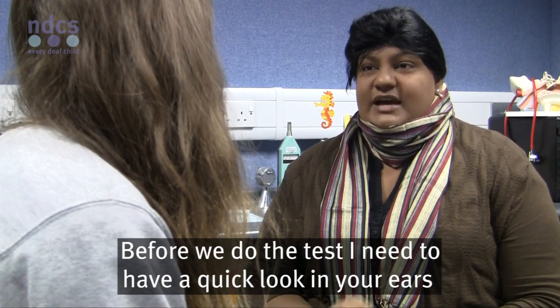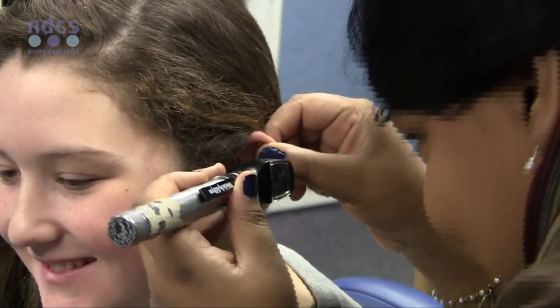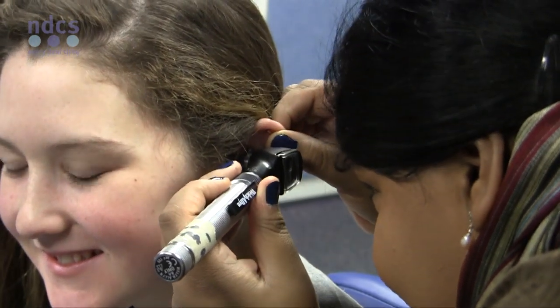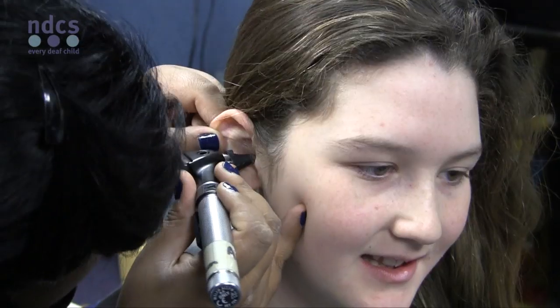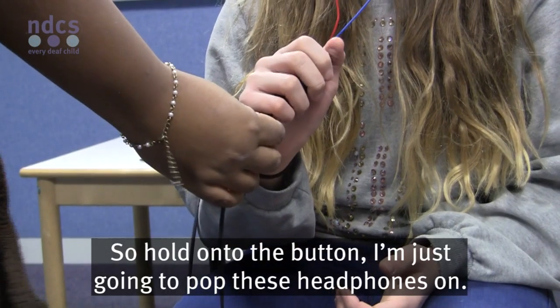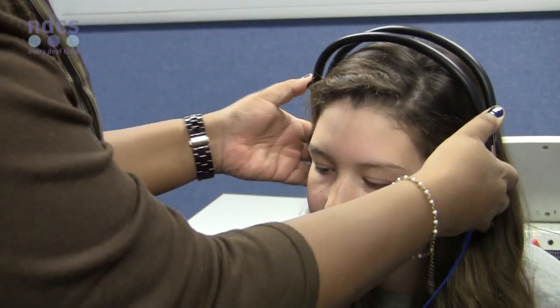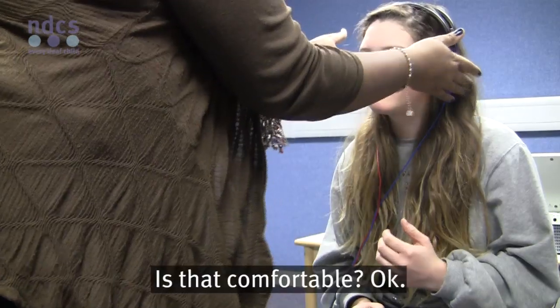Before we do the test, I need to have a quick look in your ears with my light. Is that okay? Brilliant. So hold on to the button. I'm just going to put these headphones on. Is that comfortable?